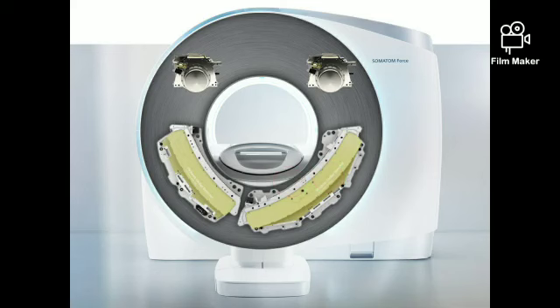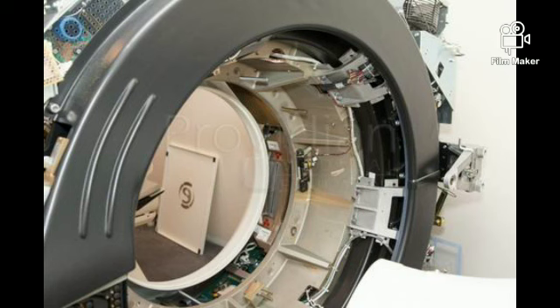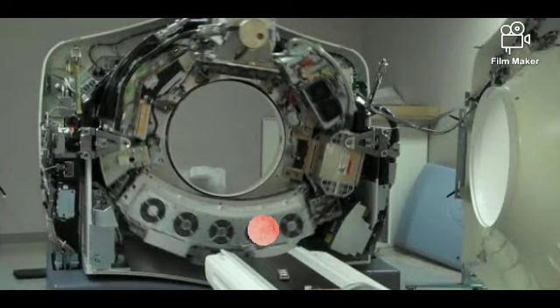So next is, see, this is the inner view of the CT scan machine. The yellow ones are the detectors and the black ones are the x-ray tubes. Okay, so this is what is inside the gantry. Mainly it consists of two collimators also, a pre and post patient collimator. So this is the inner view of your CT scan machine. Keep in mind that the detectors may be in a 180-degree arrangement also, or fully divided into two types. So the one below is the detector and the one above is the x-ray tube. It has high tension cables inside too.